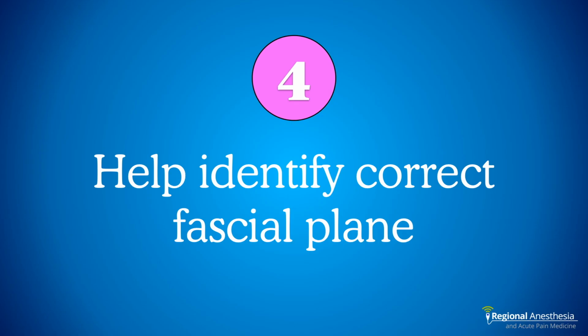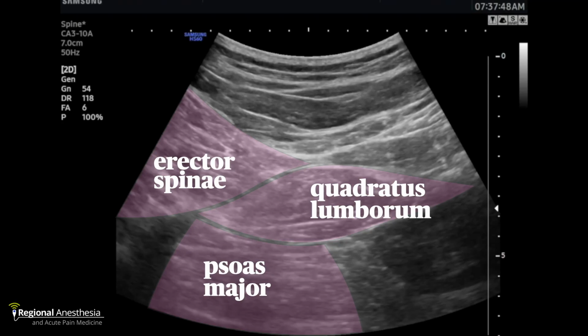And then finally, stimulation helps to find the correct interfascial plane. And this is a kind of a different way to use a nerve stimulator device. Take the anterior QL block, for example. I want to land that needle right here between the QL and the psoas major, right in that plane. The problem is, if you put the local in the psoas muscle itself, you're going to end up with a lumbar plexus block. And we did this a number of times. You get great abdominal coverage. Oh, and guess what? You can't move your left leg because we've taken out your quads with a lumbar plexus block.